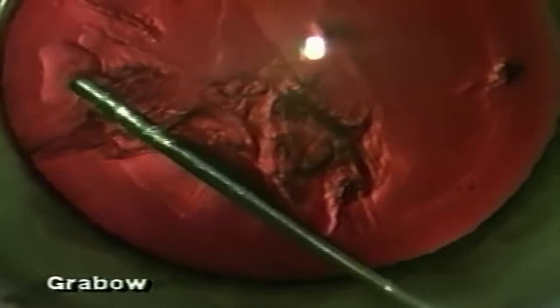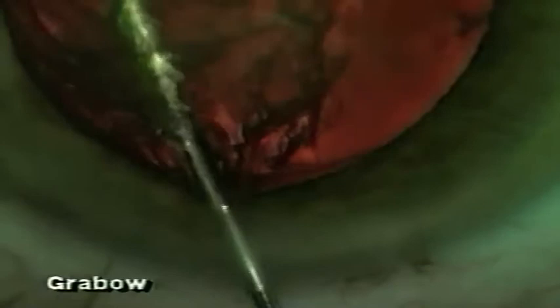Hydrodissection is then performed after Howard Fine's technique of cortical cleaving hydrodissection, attempting to place the tip of the cannula just inside the capsule and directing the wave between the capsule and the cortex. For most cases, I try not to hydro-express the nucleus, but as soon as I see the nucleus rise up out of the bag, knowing that there is BSS behind the nucleus, I will stop injecting and tamponade the nucleus back through the capsular rexis into the capsular bag.